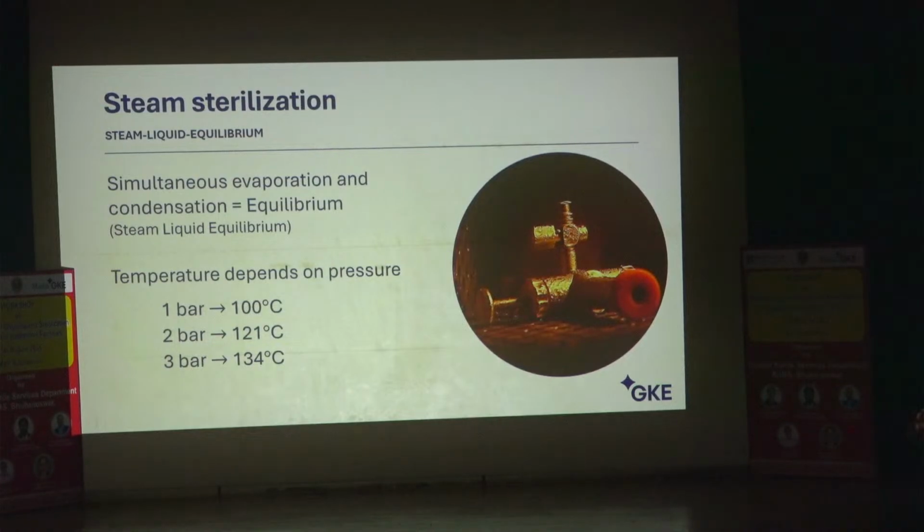Does the steam penetrate? Or does it remain dry inside? Now you suddenly see, I need steam penetration, because if the steam cannot enter these positions, they will remain dry. And this is why we need our testing to ensure that steam penetration has been successful.